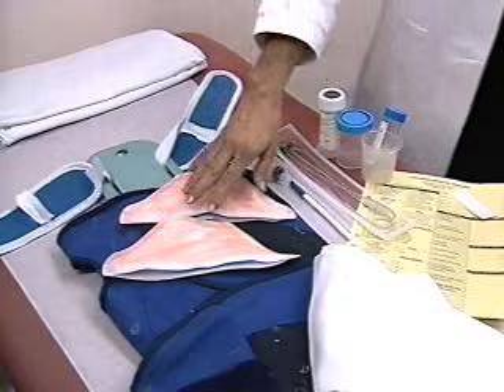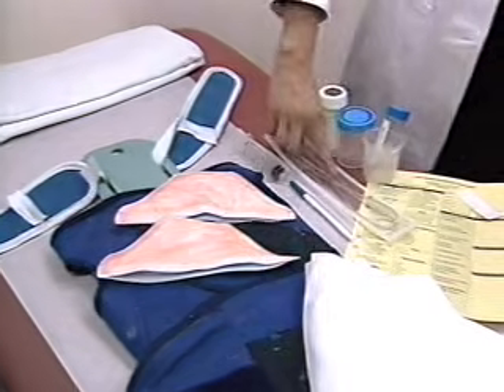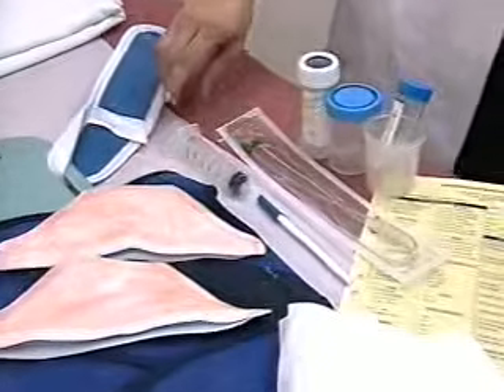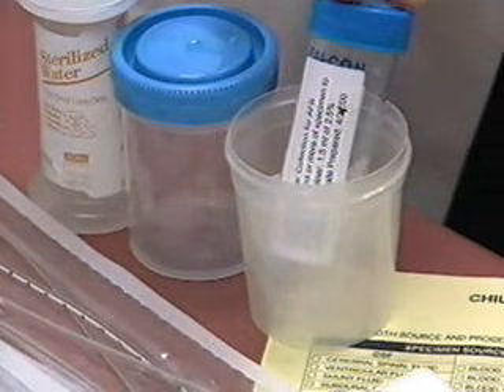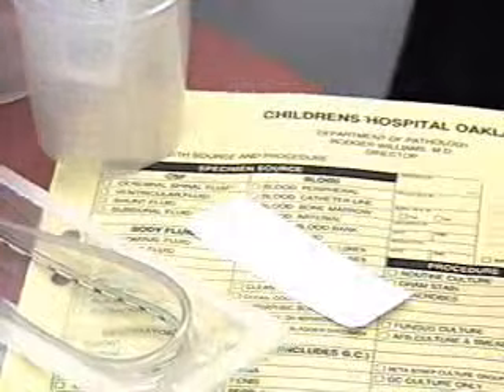Ready to learn how to collect a gastric aspirate on your pediatric patient? Please see your printed materials for a sample instruction sheet for parents, as well as other information about collecting a gastric aspirate. The whole gastric aspirate collection procedure takes a matter of minutes, so you'll need to collect everything in advance: N95 masks for the protection of the staff, a papoose board and sheet for restraining the child, a 10 French or larger nasogastric or suction tube, and a 30cc syringe with appropriate connector for your tube. You'll need a pen, a bottle of sterile baby water, a specimen cup, and a bicarbonate tube. If your lab does not supply a pre-prepared tube, make sure to promptly transport the specimen to the lab for neutralization of the gastric acid. You'll need a requisition and label and a good helper.